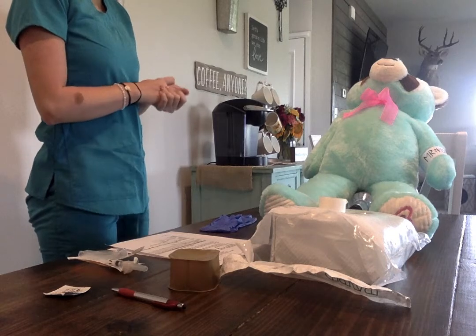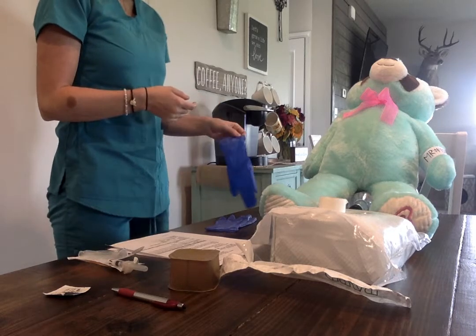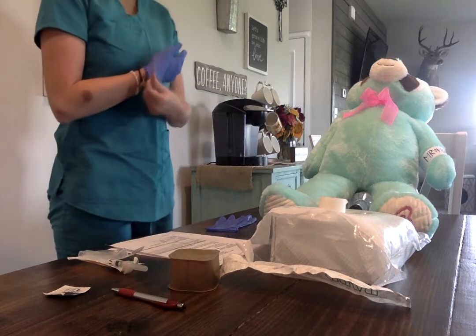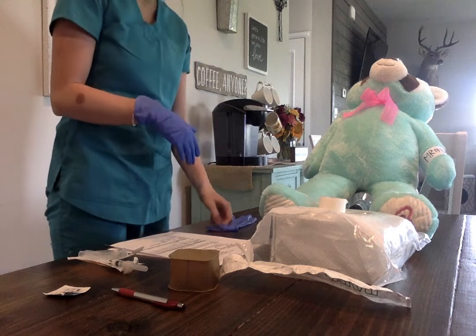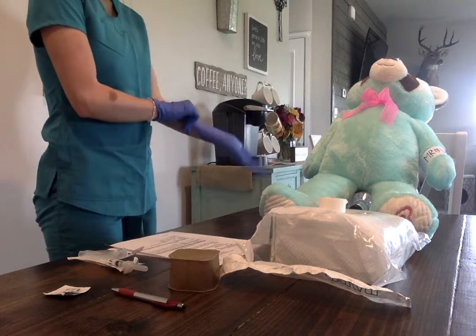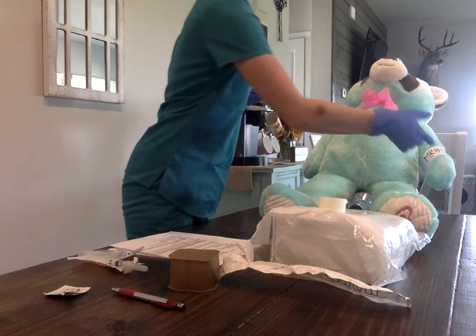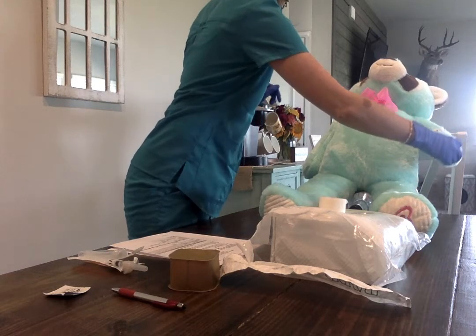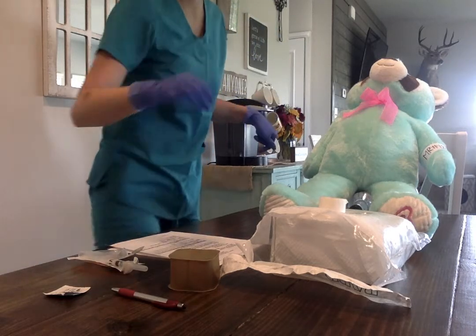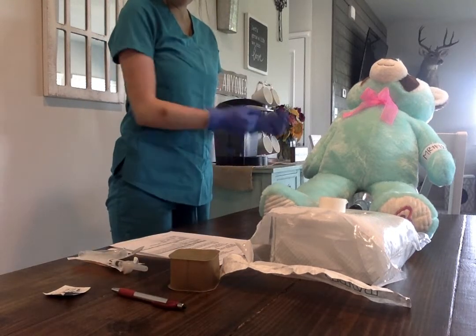Hi, Mr. Perez. My name is Taylor. I'm an ACC nursing student. I'm going to be giving you your medication today, and I'm going to be inserting a foley cath for you since you are going into surgery. Can you give me your name and date of birth, please? Okay, great. I'm just going to double check that MR number. You don't know it by chance, do you? Okay, great. 1, 2, 3. Gotcha. Okay, I'm going to lower the bed rails and raise the bed to a working position.